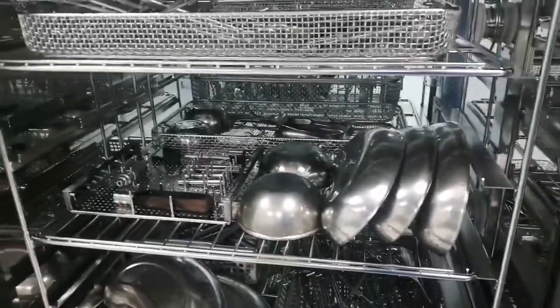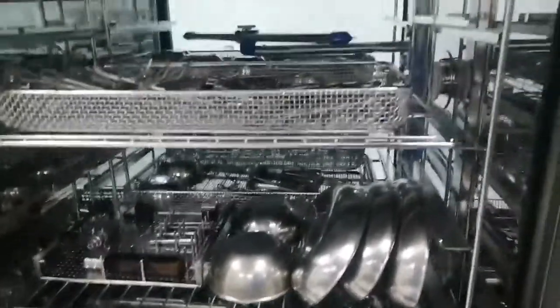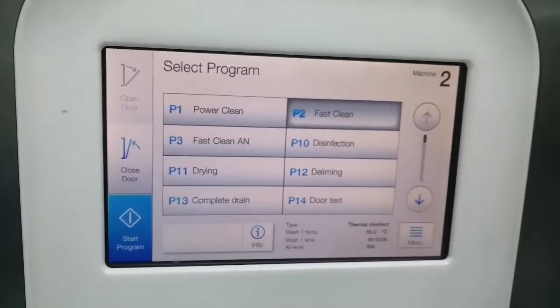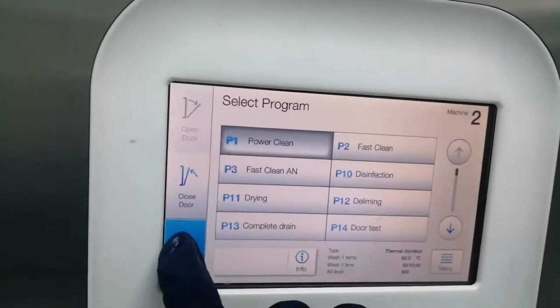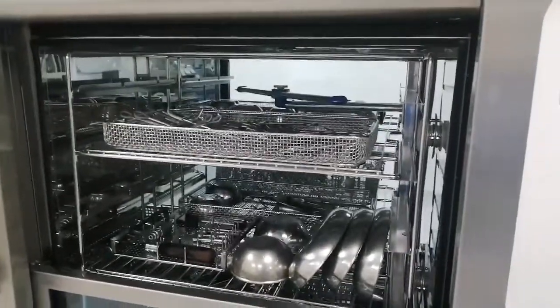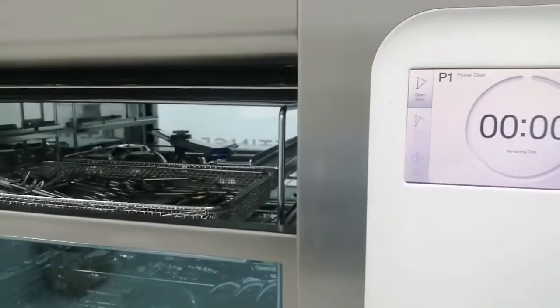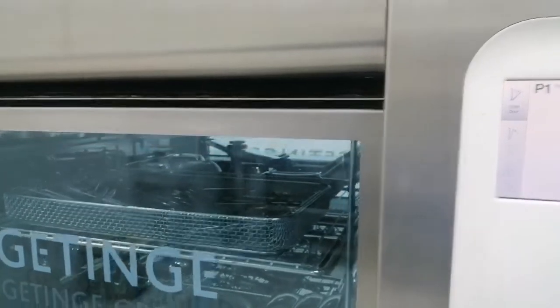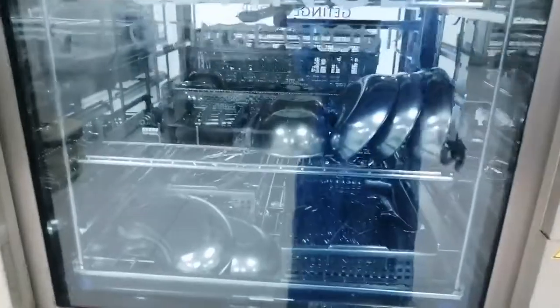Now I have put the instruments into the washer disinfector — this is the final destination of instrument cleaning. This is automatic cleaning. There are two types of cleaning we perform in the decontamination area: manual and automatic. This is the automatic cleaning by means of the washer disinfector.